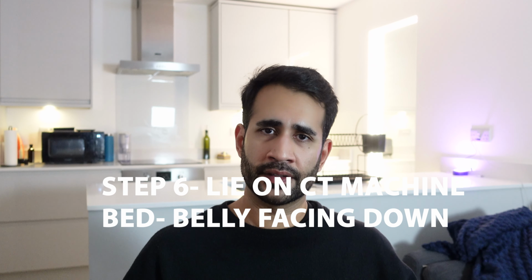Now, in order to do this procedure, the needle and the procedure will be done through your lower back region. So obviously that will need to be facing upwards. So you'll be lying on your belly typically for this type of study. And that's the way the procedure will be done. It doesn't take too long. So if you are worried that you'll find it quite uncomfortable lying on your belly, it is quite quick.